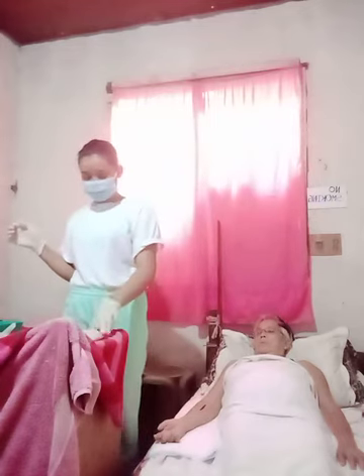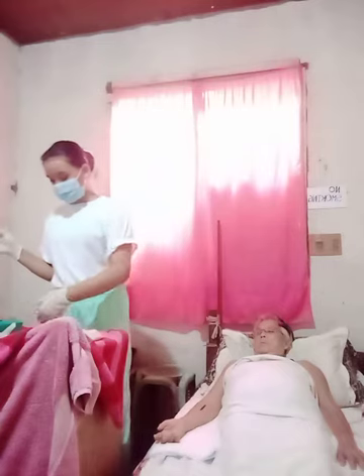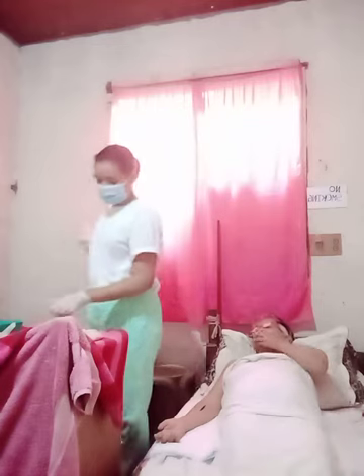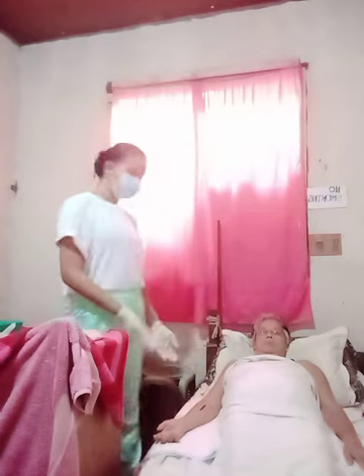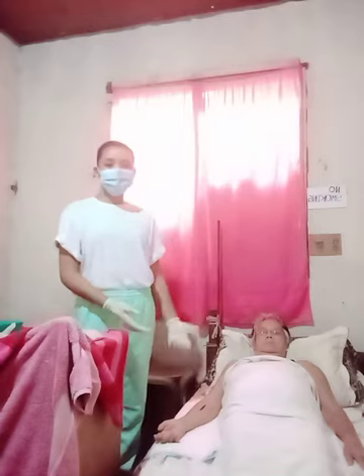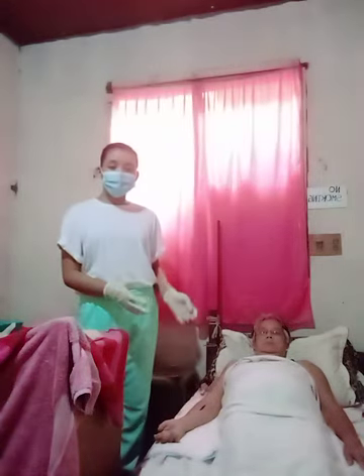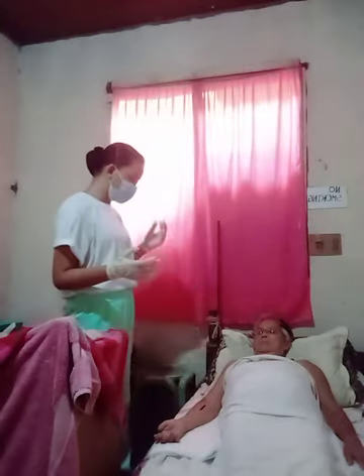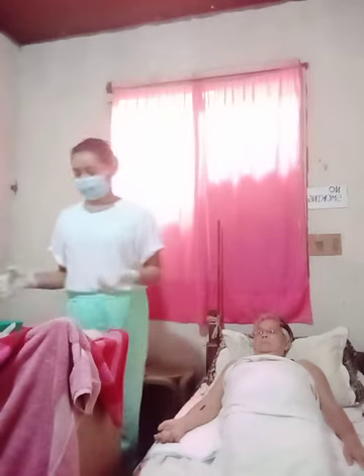Now we're going to pick up the forceps. Apply sterile gloves. Next is to inspect the wound for appearance, drainage, and integrity. Avoid contact with contaminated material. Cleanse the wound with solution, using a separate swab for each cleansing stroke.